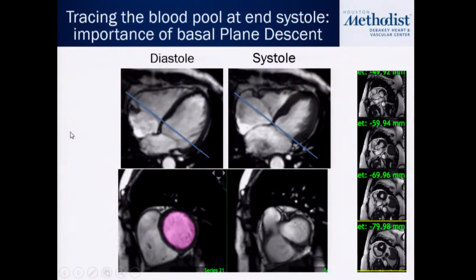And the key part is to remember to make sure your tracings match with your visual assessment. That applies to whether it's CMR or echo or elsewhere.